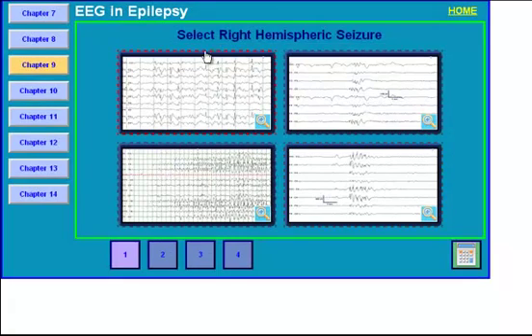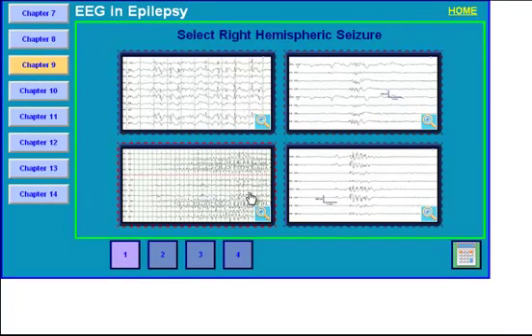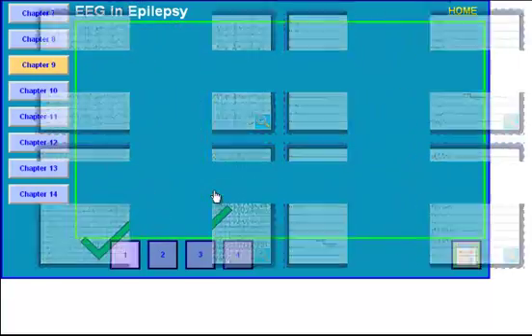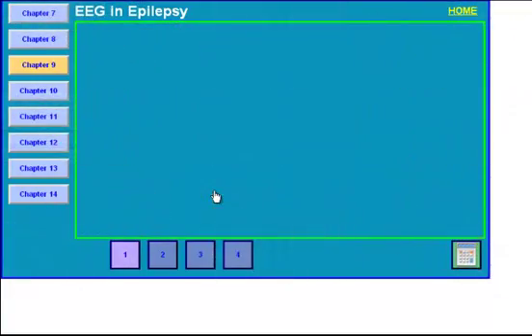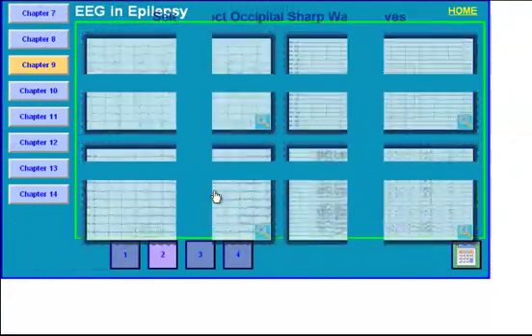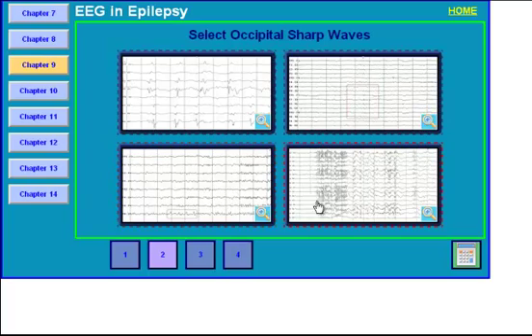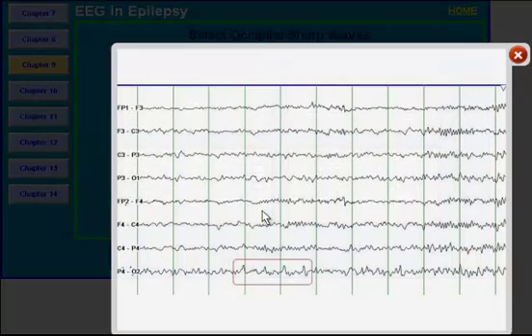So the answer select right hemispheric seizure. What I will mark here is here. And this is the right answer. And we will move on to the next slide. So select occipital sharp waves.